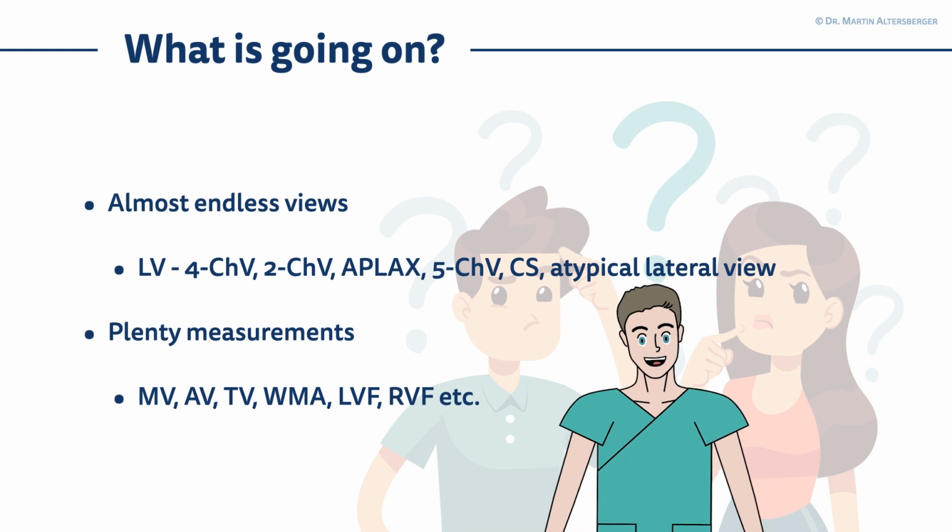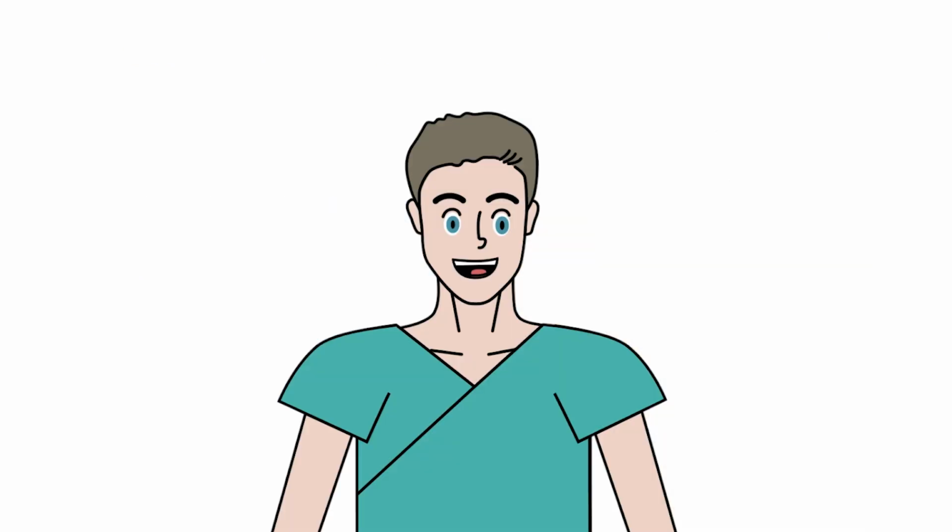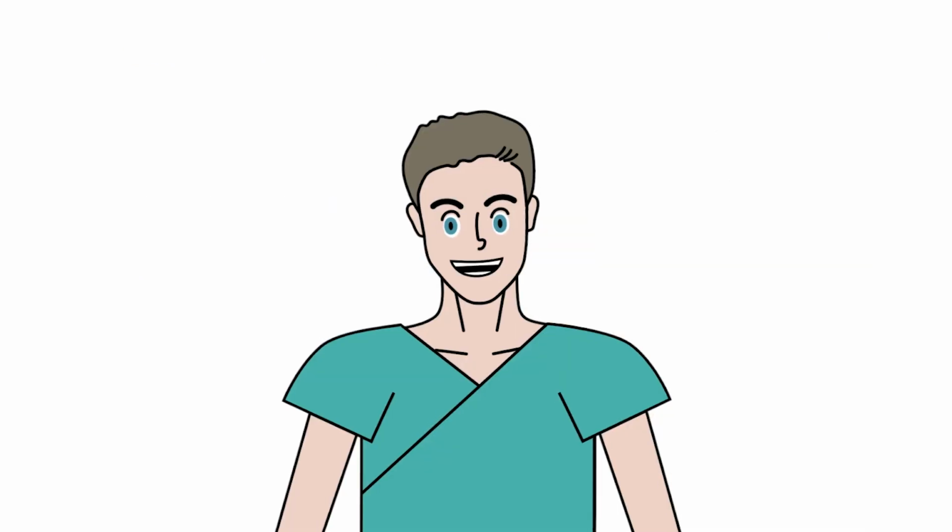If you're interested in evaluating the right ventricle, go to the designated video and check it out to see how the right ventricle and how right ventricular pathologies can look and present. Furthermore, this video sums up the apical views with a focus on the left ventricle.